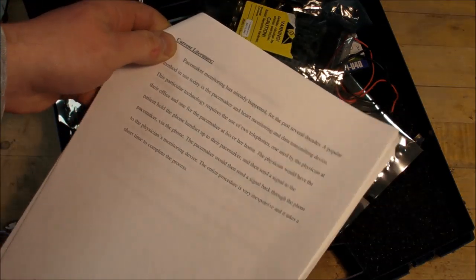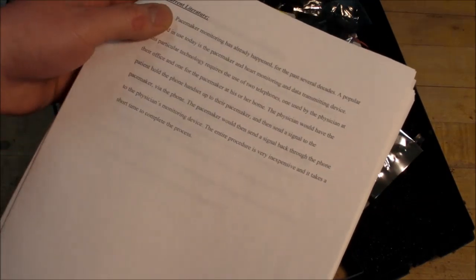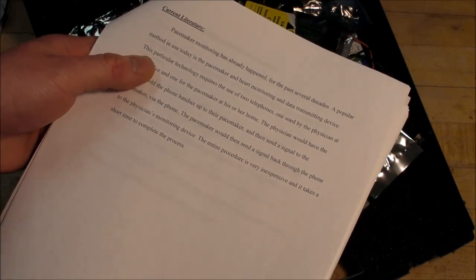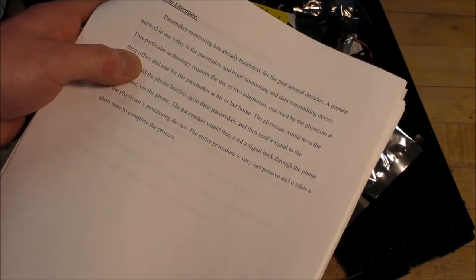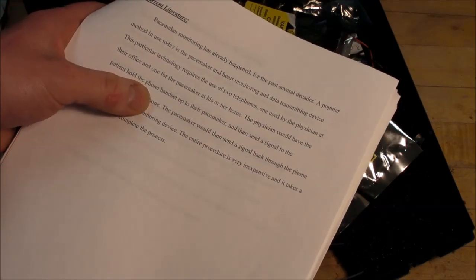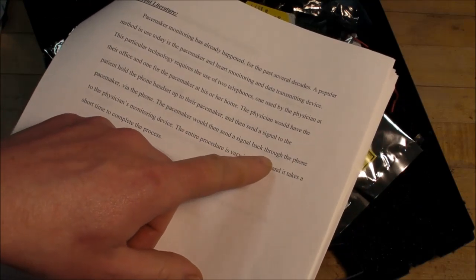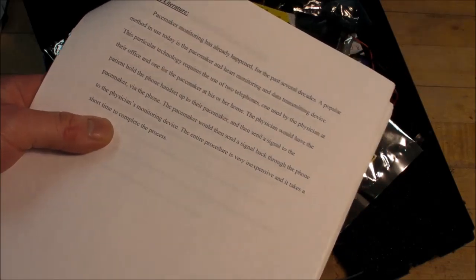Apparently, one way to communicate with pacemakers is, I'll just read this. Pacemaker monitoring has already happened for the past several decades. A popular method in use today is the pacemaker and heart monitoring and data transmitting device. This particular technology requires the use of two telephones, one used by the physician at their office and one for the pacemaker at his or her home. The physician would have the patient hold the phone handset up to the pacemaker, and it would send the signal to the pacemaker via the phone. The pacemaker would then send a signal back through the phone to the physician's monitoring device. And the entire procedure is very inexpensive, and it takes a short time to complete the process.